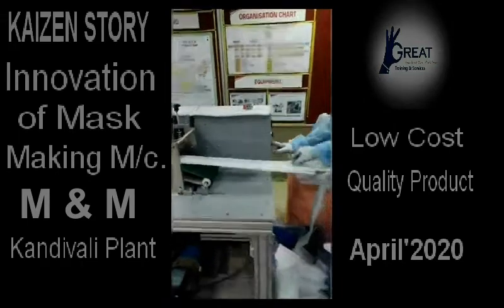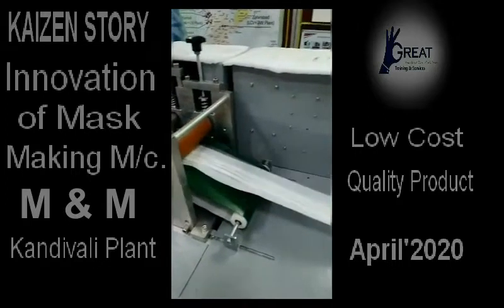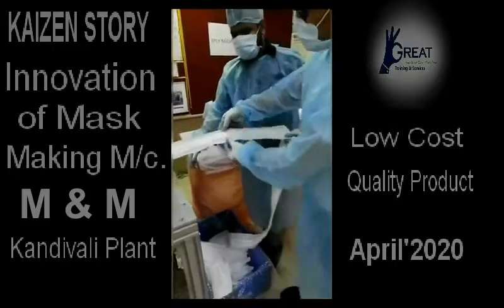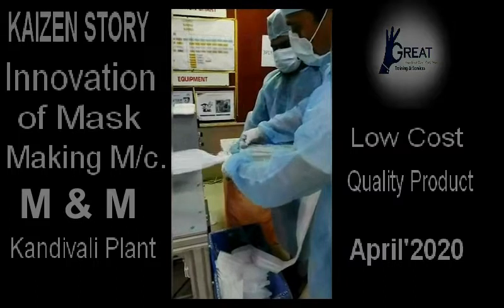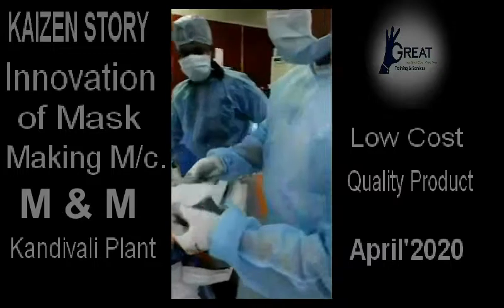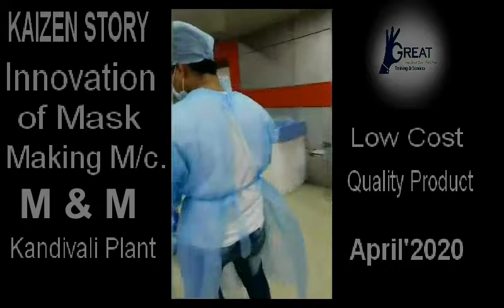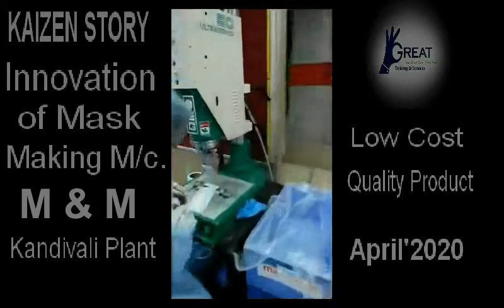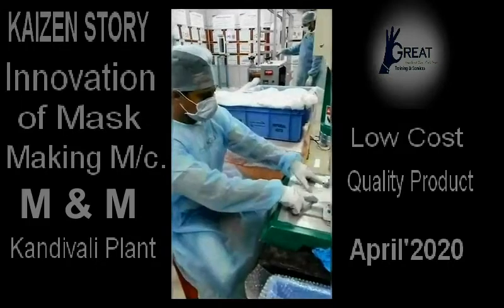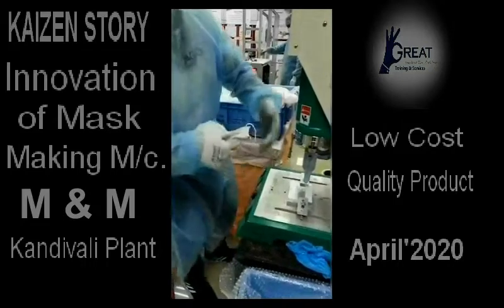I will show you a demo of how it is working. This is our final product — this is our mask. Next it needs ear looping, ear loop bonding. We keep the loop here and here and press it. This half will come here and it will do the weld.